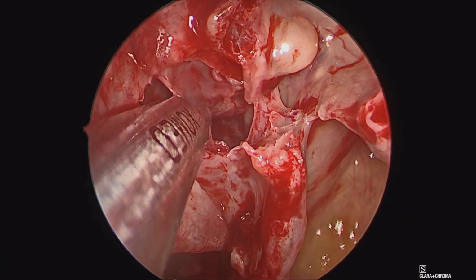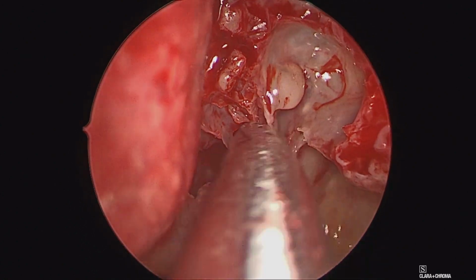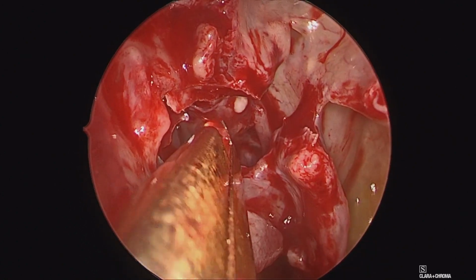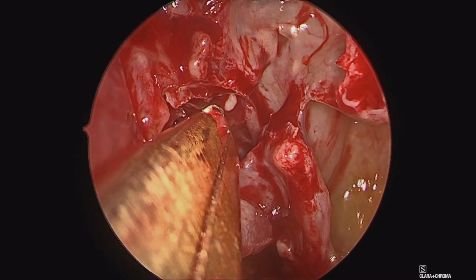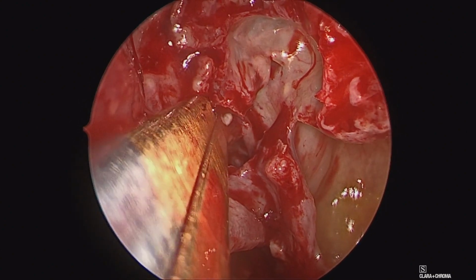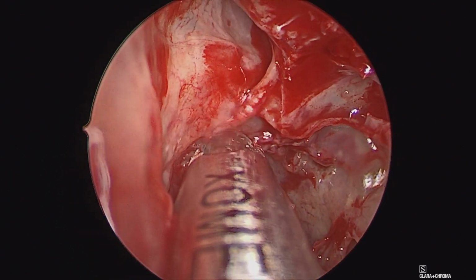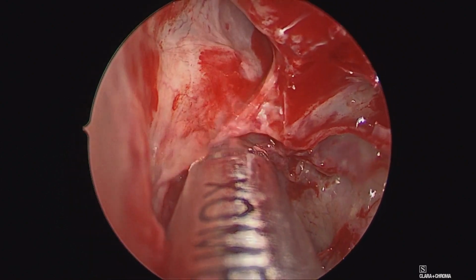This is a microdebrider, again removing the basal lamella superiorly and then laterally out towards the orbit, then coming back in with an up-biting Carlson to further facilitate a higher dissection here along the basal lamella. And what you'll begin to see is the tumor again just behind this area of the basal lamella, in the ethmoid cavity posteriorly.